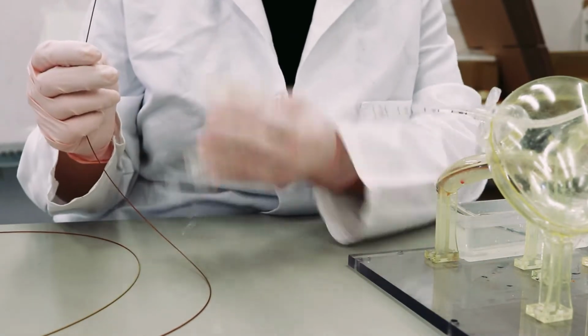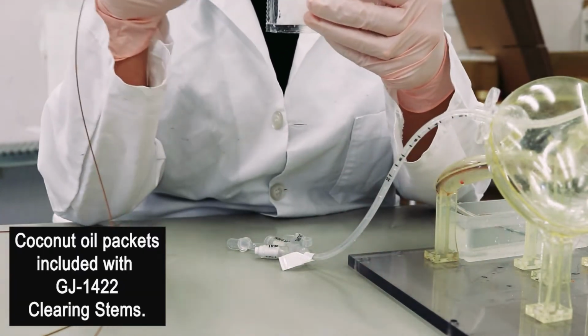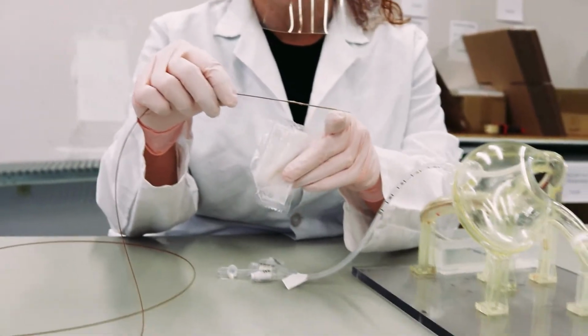Okay, so we are clogged. First things first, after we confirm that our tube is clogged, we want to take our clearing stem and coat it with the coconut oil lubricant. This helps to ensure that the clearing stem can advance through the silicone tubing.